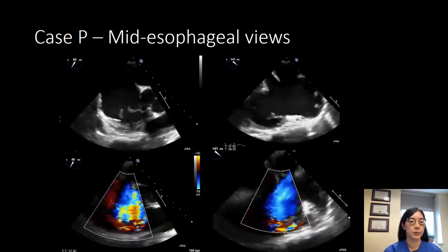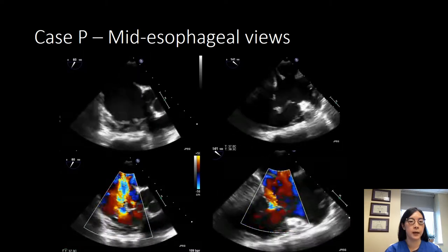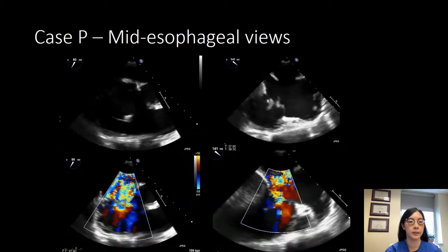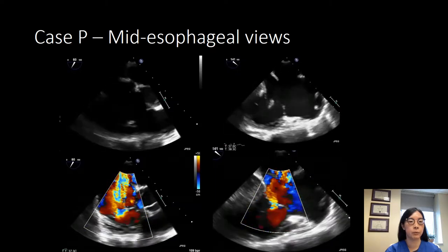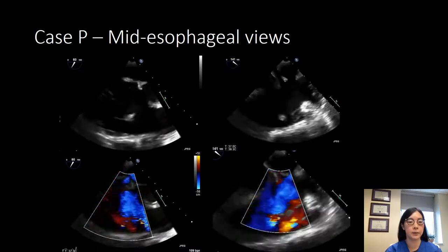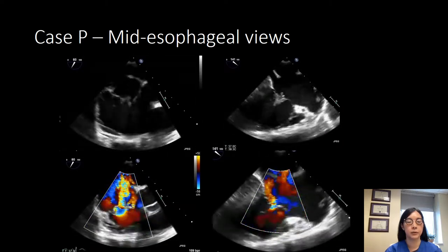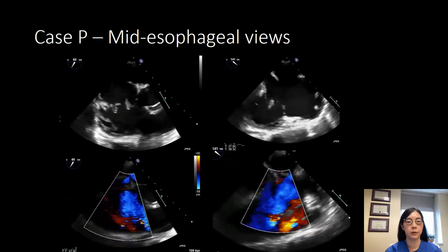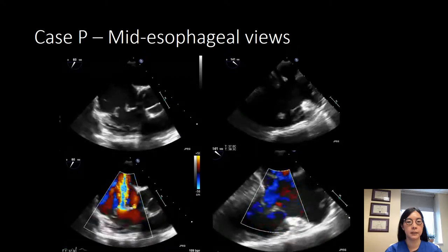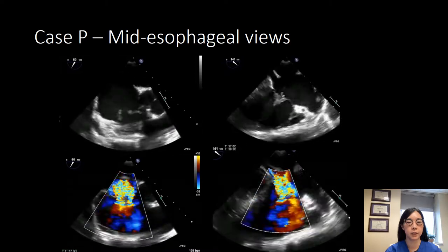We've pulled back up and we're more mid-esophageal again in a short axis inflow-outflow view of the right heart. You can see two leaflets: the anterior, which is more towards the aortic valve, and the posterior leaflet, which is more lateral. There's vegetation clearly on both as well as a jet coming between the two of them. On the right image we're in an off-axis four-chamber view — very posterior, because you can see the coronary sinus coming in — with the posterior and anterior leaflets and vegetations on both.